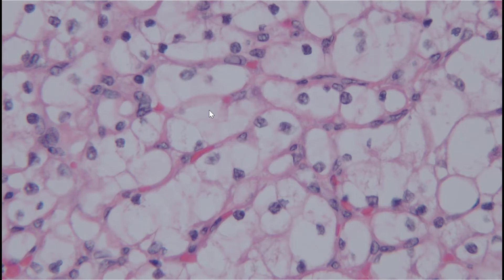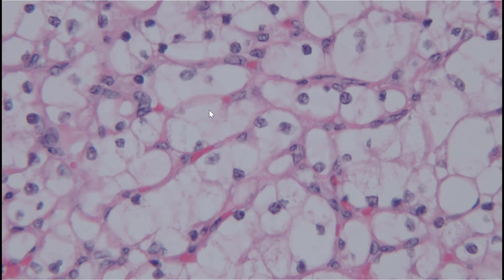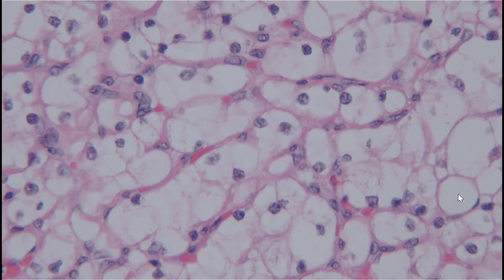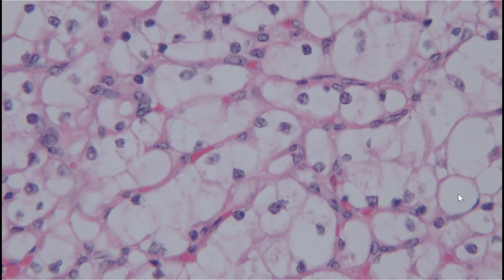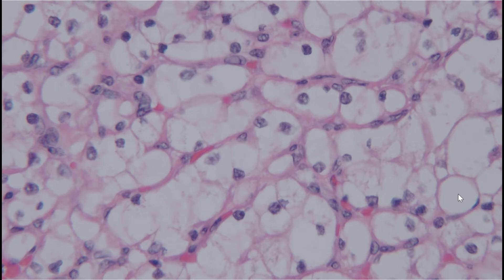The differential diagnosis for most renal cell carcinomas includes three main types: clear cell, papillary, and chromophobe renal cell carcinoma. What places this into clear cell RCC is the true optically clear cytoplasm, which represents clearing of lipids and glycogen during tissue processing. It also has the delicate capillary network, lacks papillary architecture, and lacks the prominent plant cell membranes of chromophobe RCC. This is a clear cell renal cell carcinoma, nuclear grade 2.